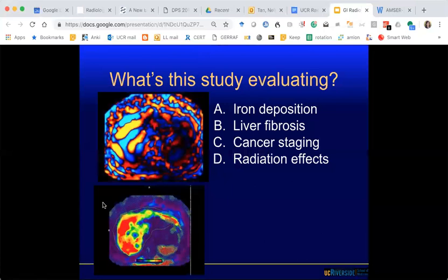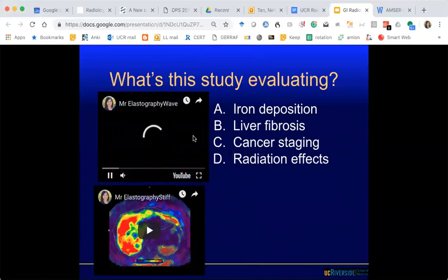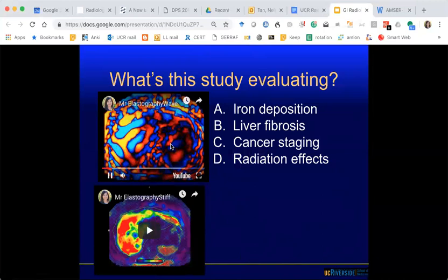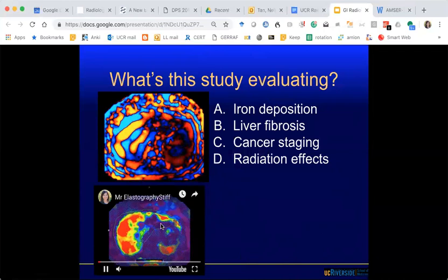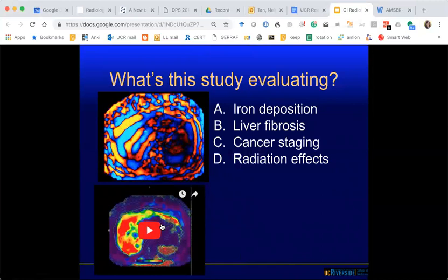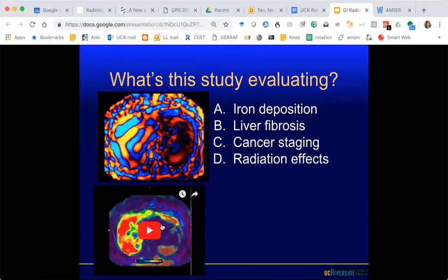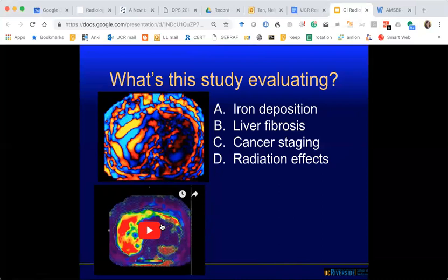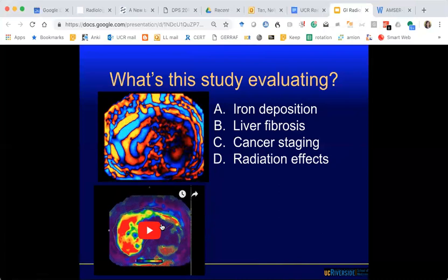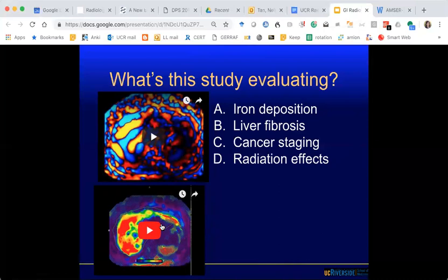What study is this? This is a WAVE study, and this is the result — called an elastogram. What is this study called? Just recently a CPT was issued, and it's indicated in patients with diffuse liver disease to assess for liver fibrosis.